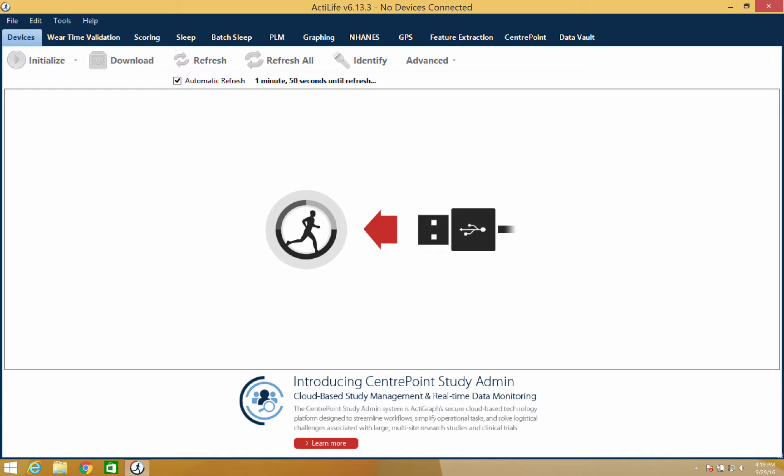Let's begin by opening ActiLife and making sure the Devices tab is selected. Once the page loads you can connect your ActiGraph device by inserting it into the docking station.